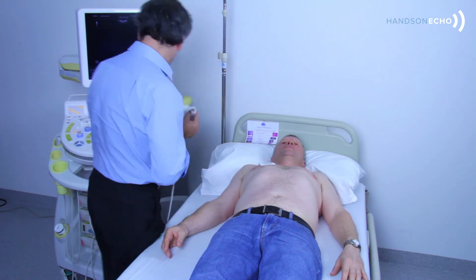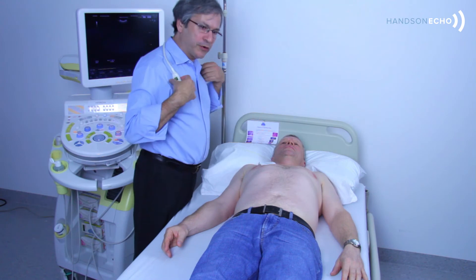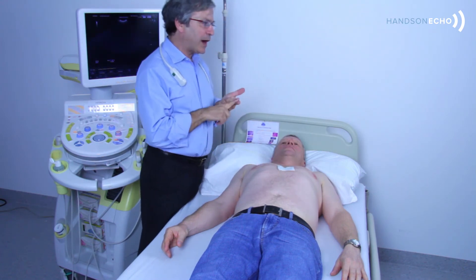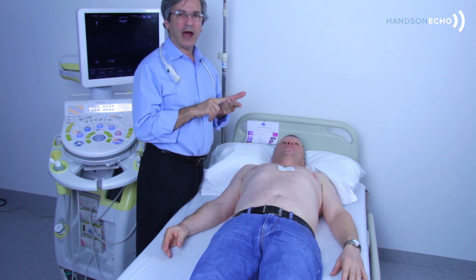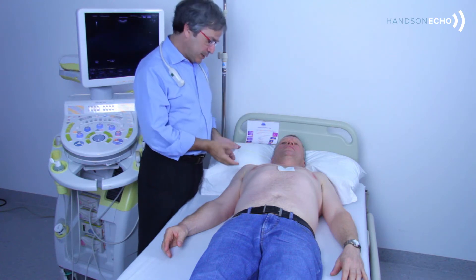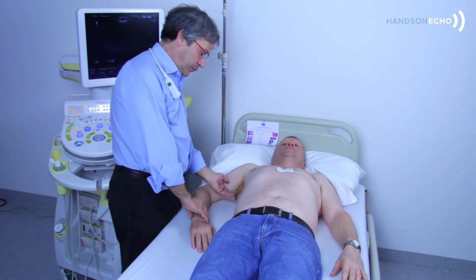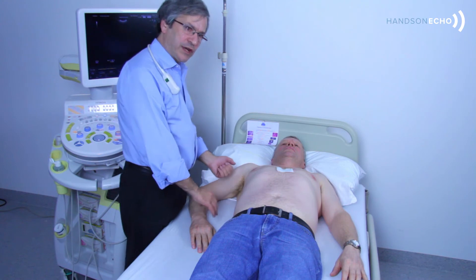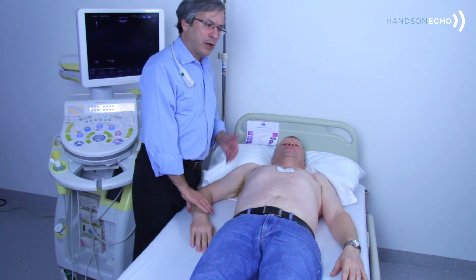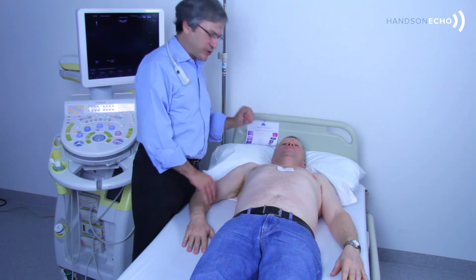We just define the PLAPS point now. PLAPS is posterolateral alveolar and/or pleural syndrome, which should be located posteriorly, and we will scan the posterior of the lung in the ventilated patient.